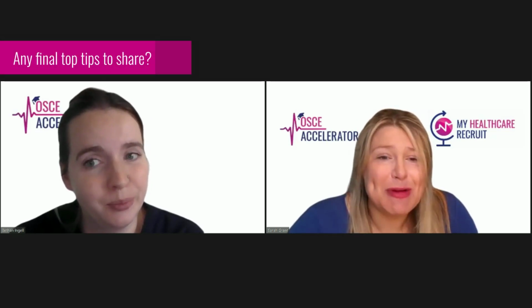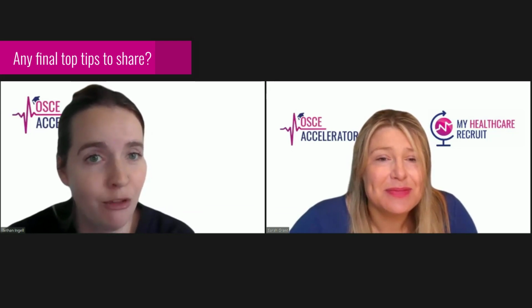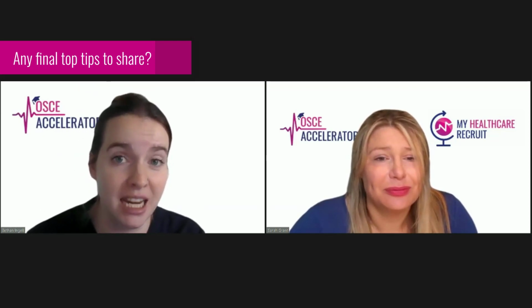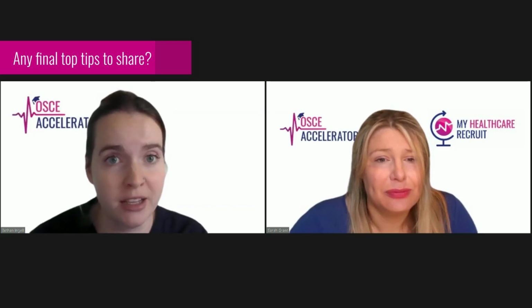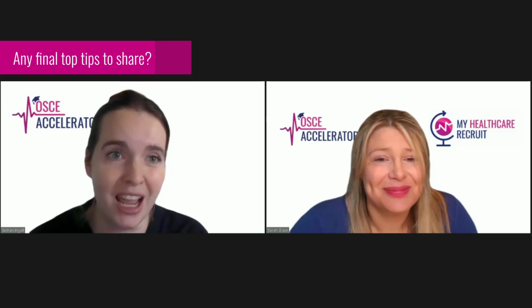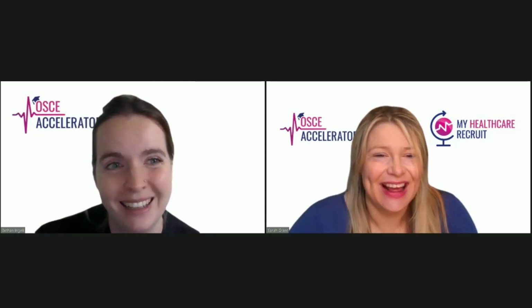Any other top tips before we wrap up for this station, Beth? So for this one, as I said, you might find you make mistakes when you explain to the patient. So what I would recommend, I know it's a bit of a pain, but explaining to the patient each time you do it. So one time before you start, obviously you're going to explain to the patient your procedure, and then you're going to do 3 readings. So talk them through it each time. This gives you 4 times to get it perfect. So don't worry if you slip up on one of them. Okay? You've got the other opportunities. You don't want to be resitting this OSCE exam. You want to get it done, don't you?